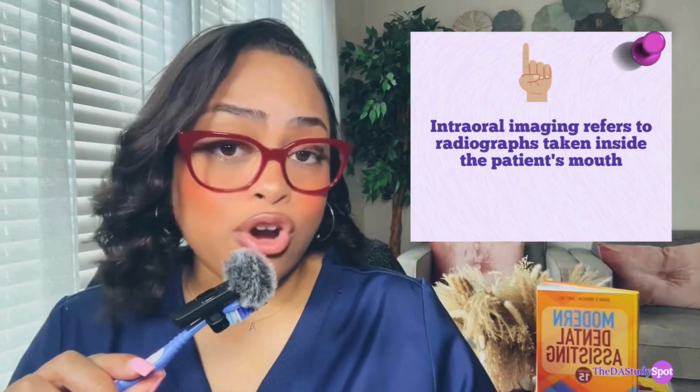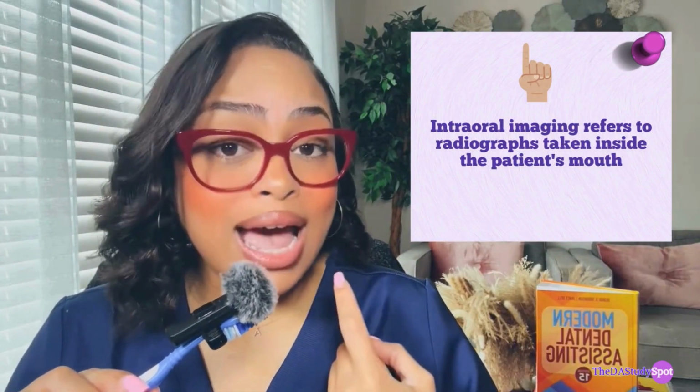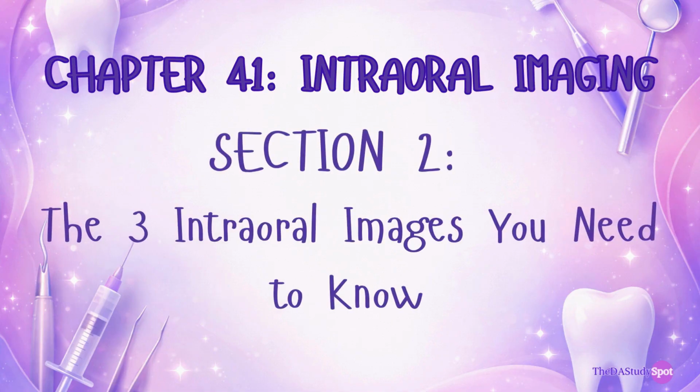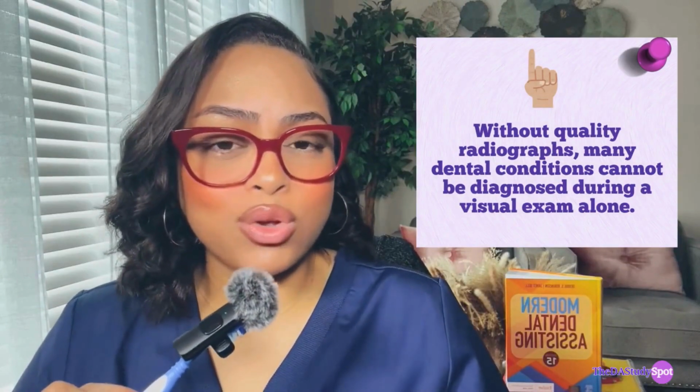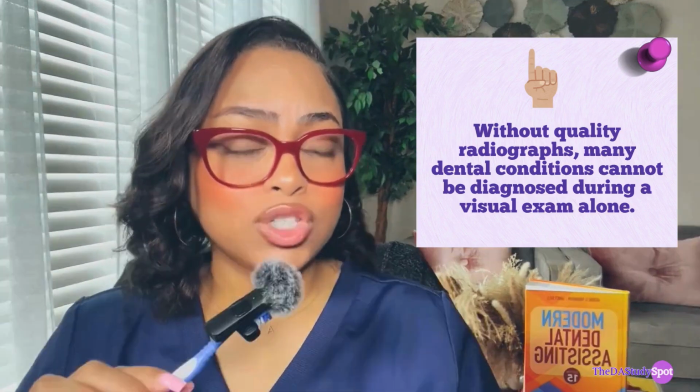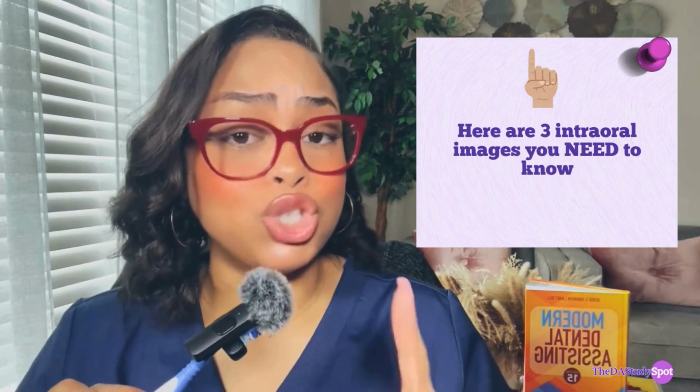Intraoral imaging refers to radiographs that are taken inside of a patient's mouth. These images help the dentist diagnose dental caries, bone loss, periapical infections, impacted teeth, root abnormalities, and changes in surrounding bone. Without quality radiographs, many dental conditions cannot be diagnosed during visual exam alone. So here are the 3 intraoral images you need to know.